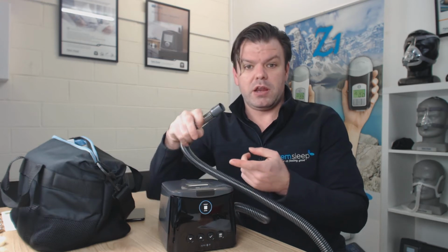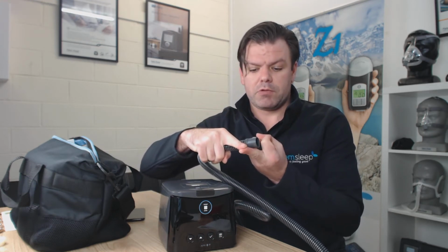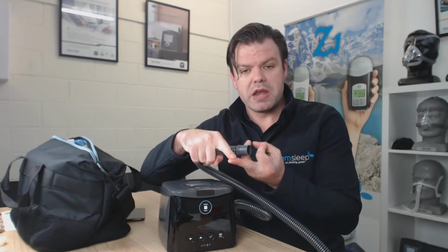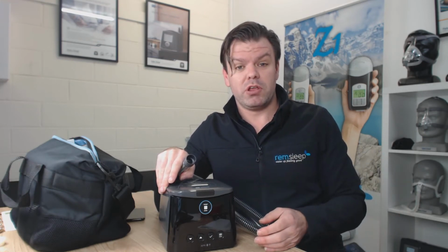It's monitoring the air temperature, the ambient relative humidity. It's monitoring the heater plate, how hot the heater plate is. It's monitoring how you're breathing. The machine's basically just monitoring everything. It's got a whole bunch of sensors in it. It's monitoring everything, and it's then self-adjusting everything to make sure that you get the best night's sleep that you can possibly get. So it's like a self-sufficient machine.